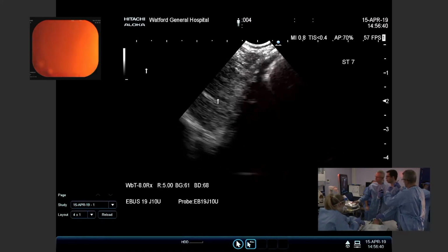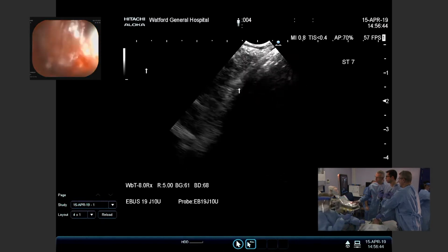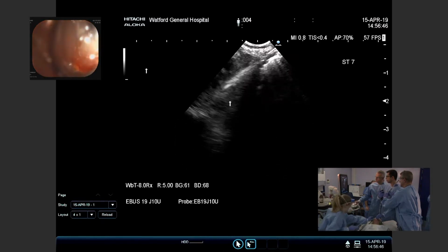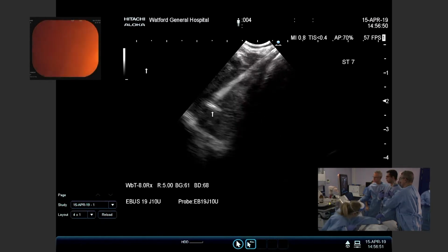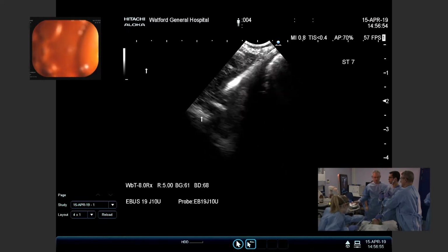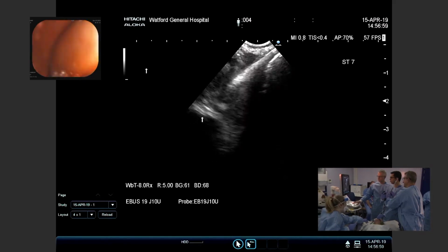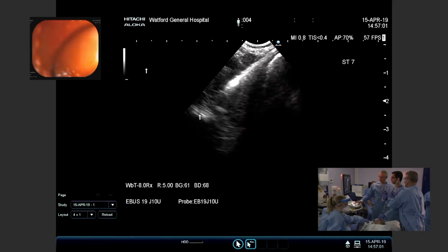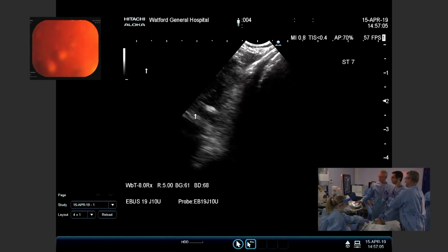So just adding on the suction syringe. And again, a two-handed technique, making sure it's all very controlled. Nice and slow, back and forth, to and fro, or agitations. So this is the second pass, same lymph node, but in a different position.